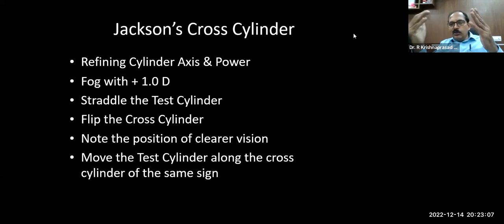So this is how you need to actually understand the JCC. And the best part is you actually start doing it. Catch hold of your friend who is wearing glasses, a refracted friend, and try to use JCC. You will come to know that all these things actually work. If you keep doing it, it becomes so easy, you'll be very confident to answer in the exam. And I'll tell you, the examiners will be very happy if you know these basics well and confidently, not just by doing it by heart and going to the exam. You actually do it yourself. Whatever I've told you, the subjective correction, you can do it on patients, on volunteers, or on yourself to see whether they all work.